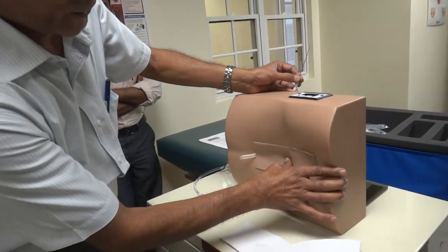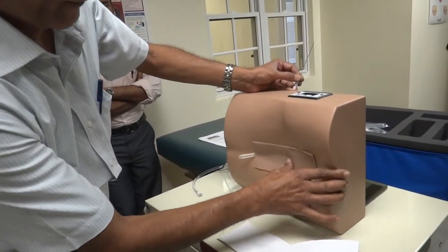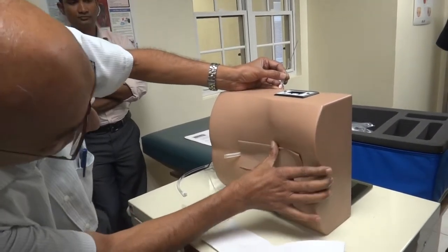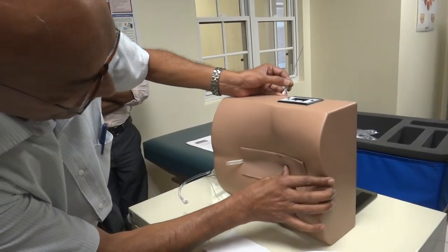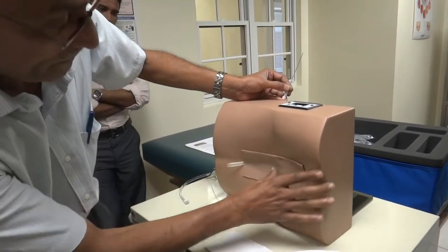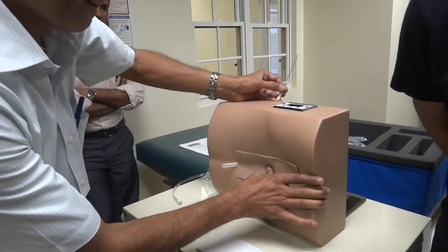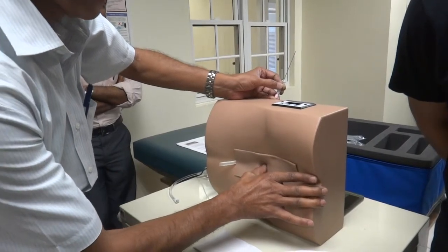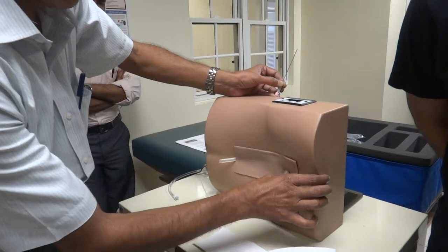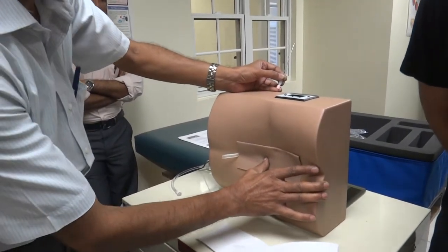L4. L3. I'm going to go between L3 and L4.